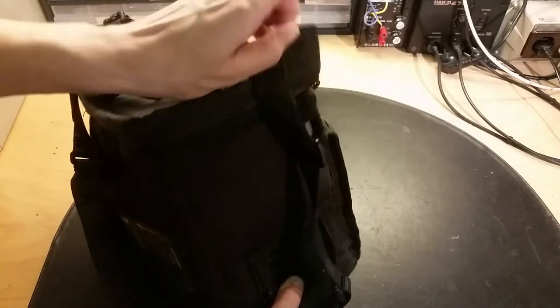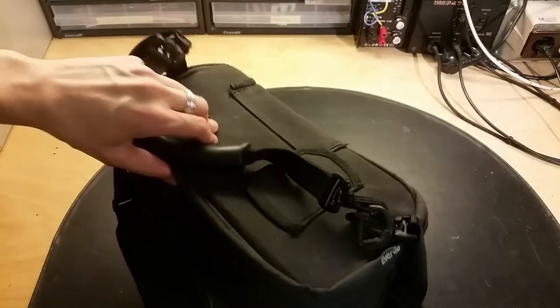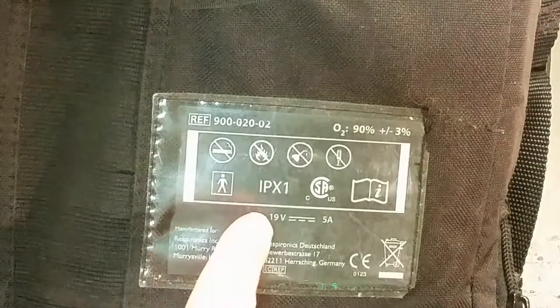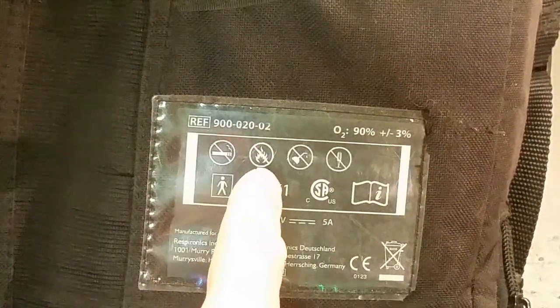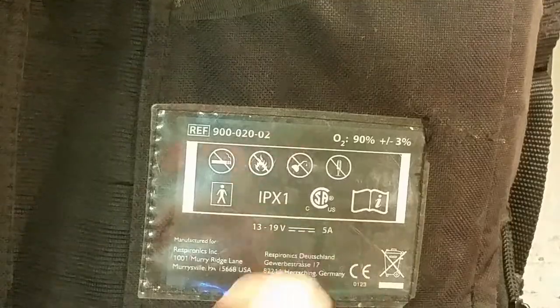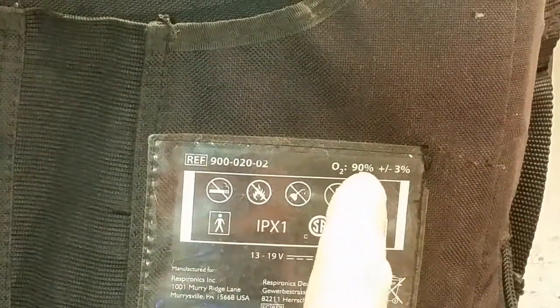Here's the charging port. We'll plug that in and turn this unit on. Here we've got some information - you can see some voltages, 13 to 19 volts. Do not smoke, no fire, do not lubricate, and don't open it up. This is exactly what we are doing.